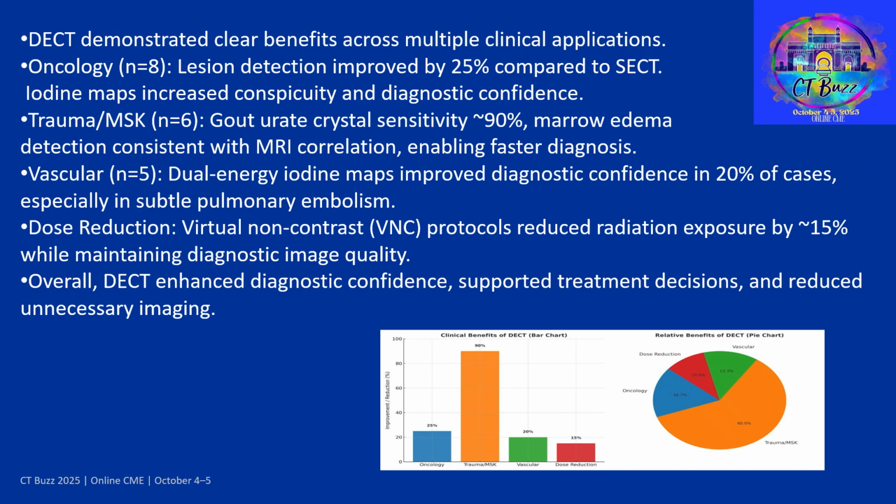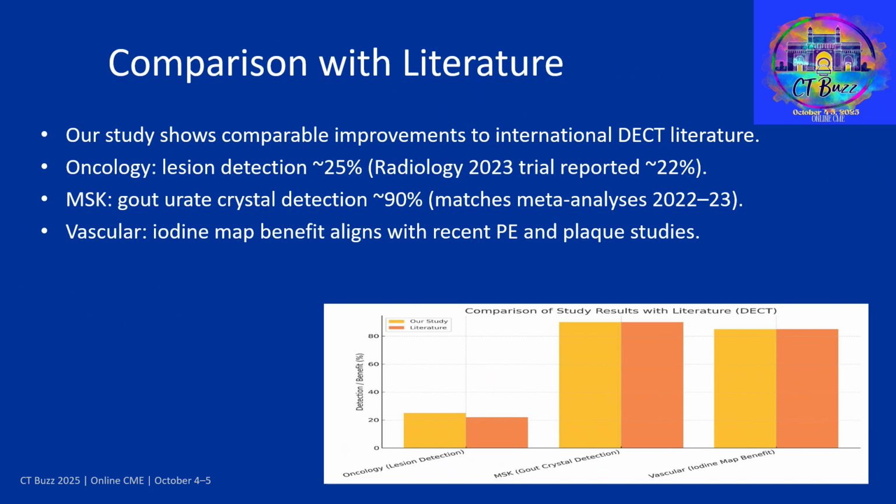Overall, dual energy CT enhanced diagnostic confidence, supported treatment decisions, and reduced unnecessary imaging. Our study shows comparable results to available literature.